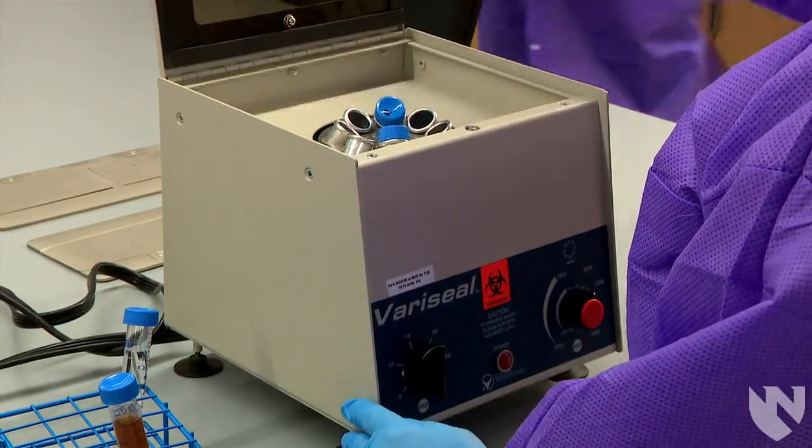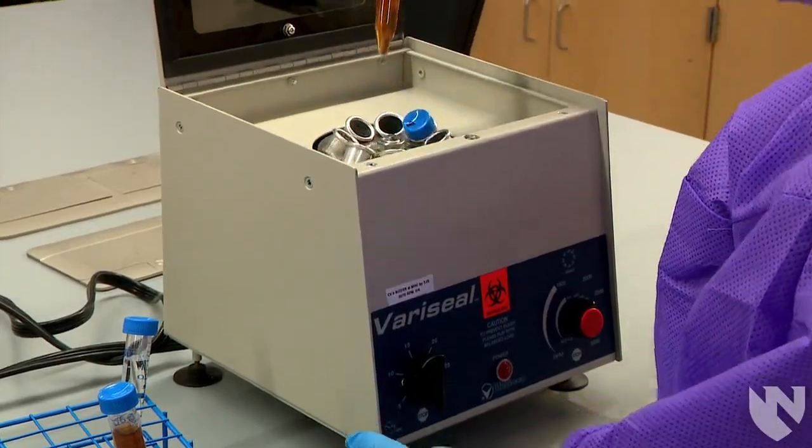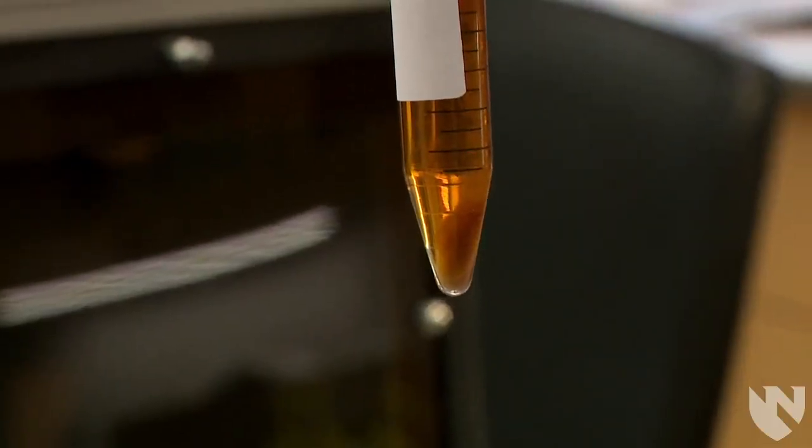Open the lid of the centrifuge and carefully remove the spun urine. You may see a pellet at the bottom of the tube. This is the sediment.